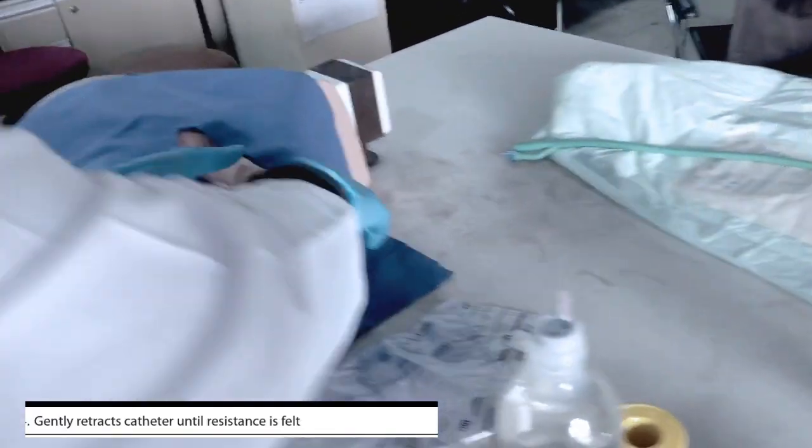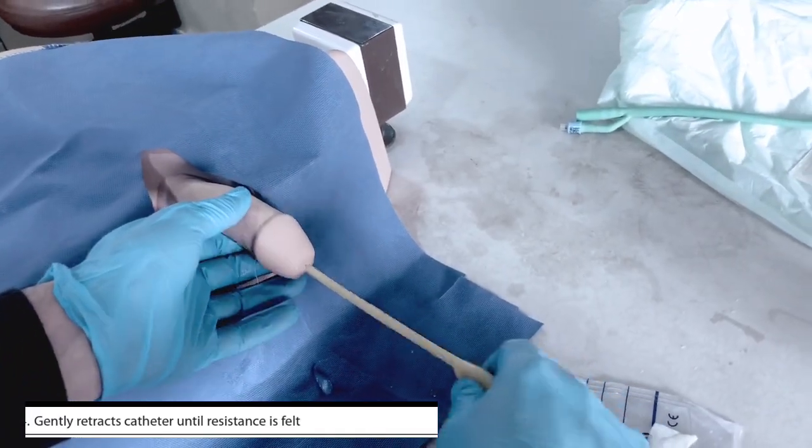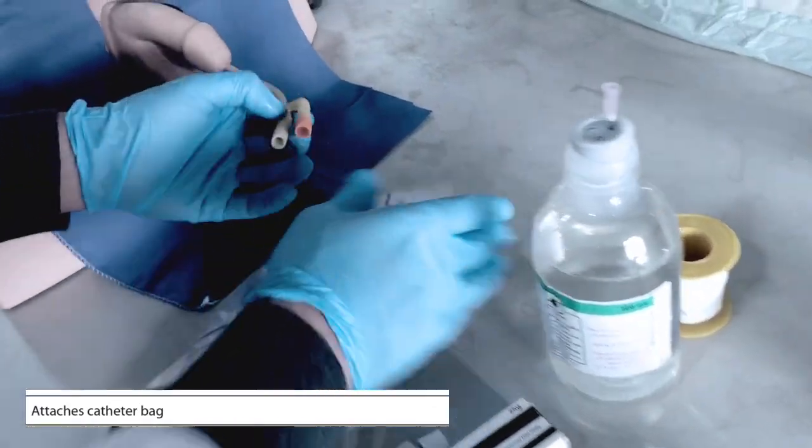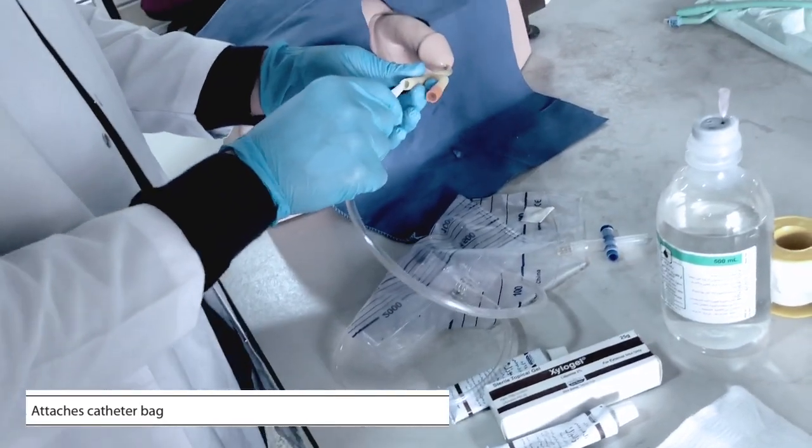Then we retract the catheter until we feel the resistance. Then we insert the catheter into the urine bag.